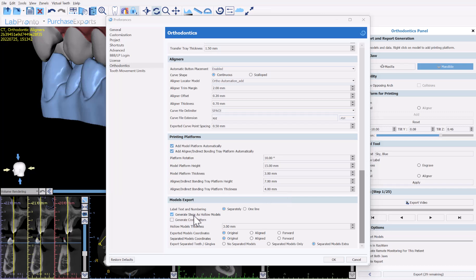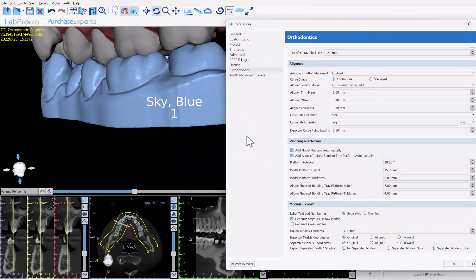There are settings for aligner or indirect bonding tray height and thickness for the platform, which you can customize. For hollow models, click the checkbox to generate them, and optionally click the checkbox to add a cross pattern to close the hollow model. The wall thickness defaults to three millimeters but can be adjusted. For labeling, you can display the label text and numbering either on separate rows or on one line.